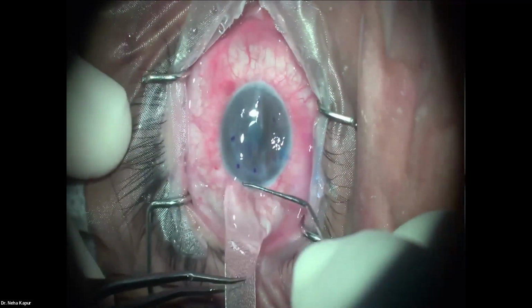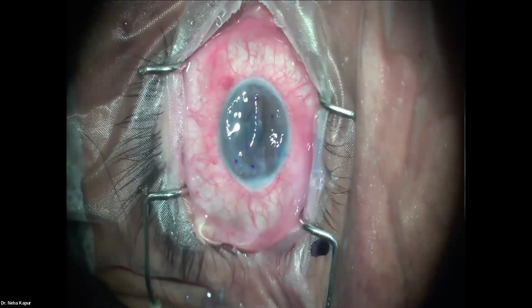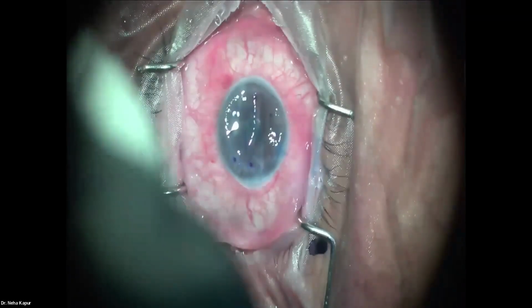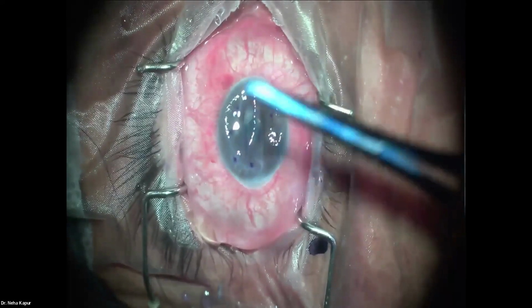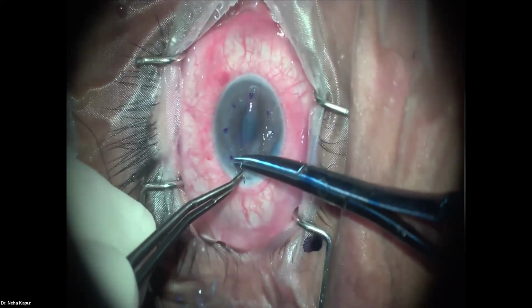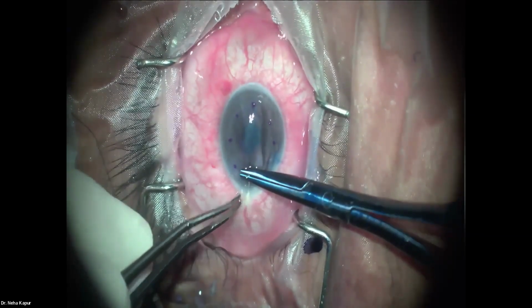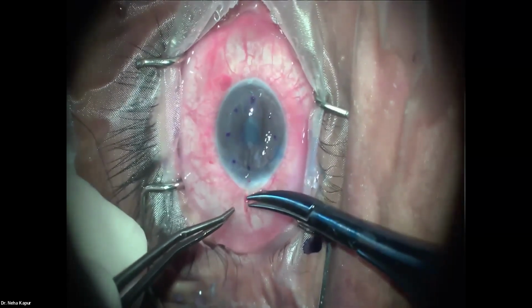Whatever be the tissue orientation in the eye, don't bother, just get the sheets glide out. Take a tissue, take a suture, and close the incision first thing. Wash.